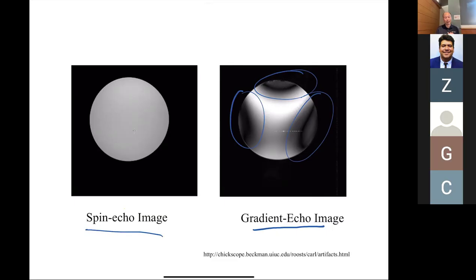That's a laboratory demonstration, but that's why when you go to your clinic and look at the scans they take on you, you'll probably notice a lot of them say FSE, like fast spin echo, or SE for spin echo. When you get your MRI images back, you can look, and there'll be things that say FOV and things like that. Generally they'll also say the name of the sequence. So you'll notice that at least probably half of them are going to be spin echoes.